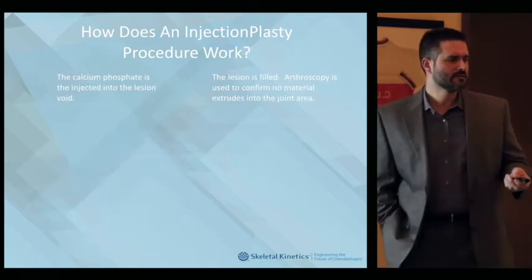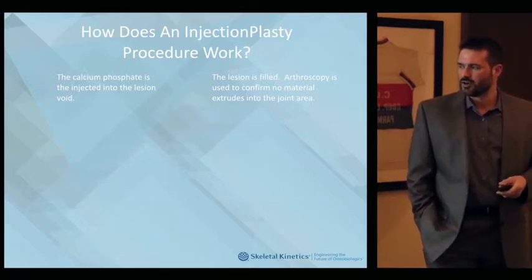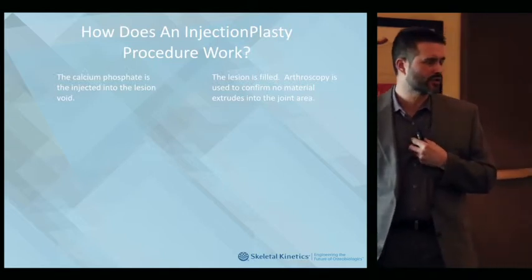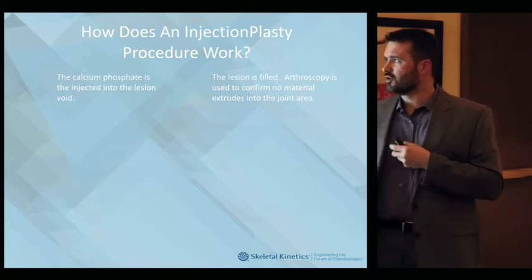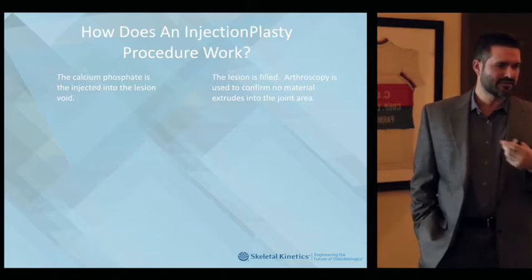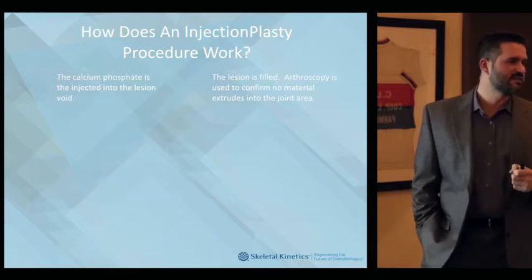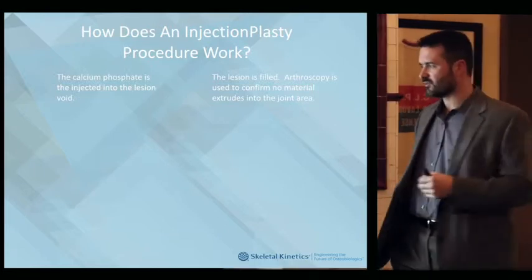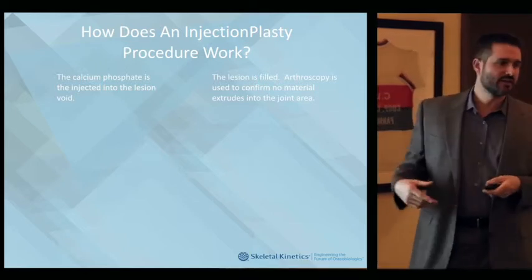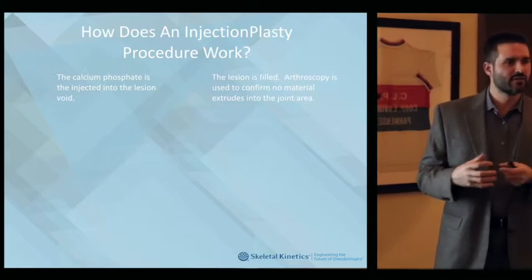So you get your MRI, and this is done in the operating room. You get your MRI and you look at all the views, sagittal, coronal, and axial. And I recommend taking your MRI into the operating room so you can look at it. And you're going to use this trocar. We used to drill it into the bone, but I think because of the heat, it's just not a good idea. And it's pretty easy. The trocar is sharp and it's easy to get in there. So you're actually just putting the trocar in, the inner portion comes out, and your assistant, hopefully, will mix it on the back table, and you're going to inject it in there. And it's going to fill up, and you will see it.